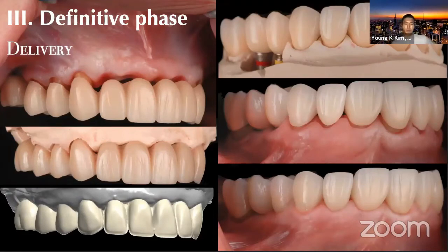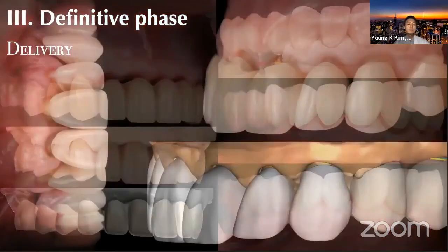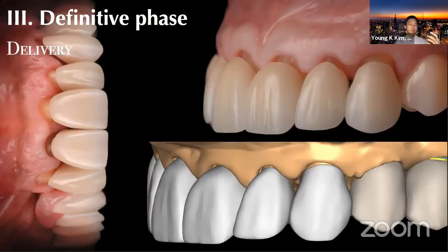The healthy tissue, oral hygiene maintenance, no question, is a must during any full mouth rehabilitation. Subgingival margins on the anterior with bone sounding, as I mentioned, allows us to expect the margins, prognosis-wise, to be less exposed in the near future. And sometimes we use pink porcelain for the lost tissue site when the patient does not prefer to have the vertical bone augmentations.